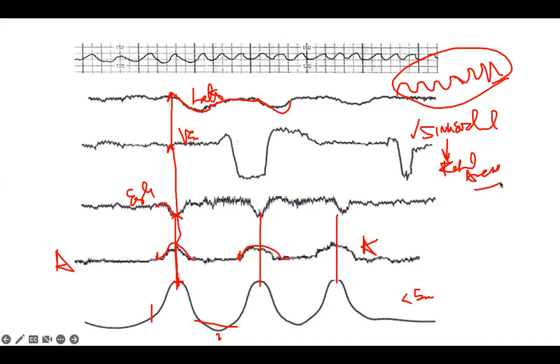And this may be Rh isoimmunization. Maybe the mommy will have, say, some Rh positive and negative interacting. So you show that the baby has severe anemia. That is dangerous. So this is another bad fetal heart tracing.